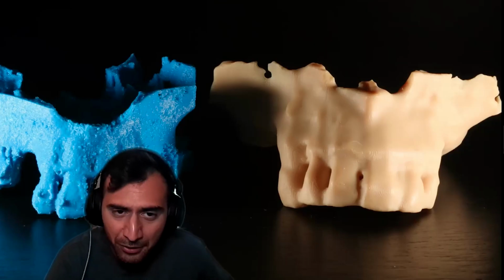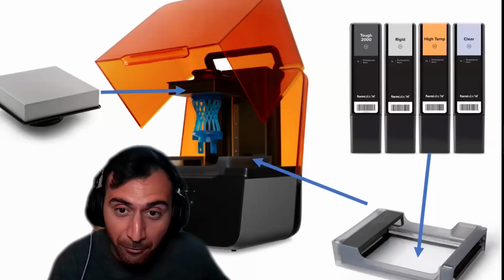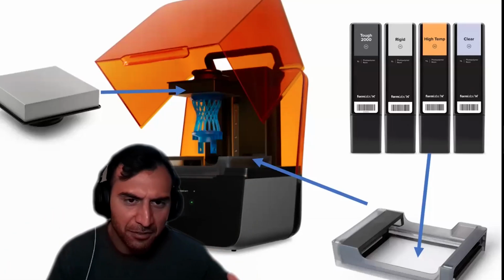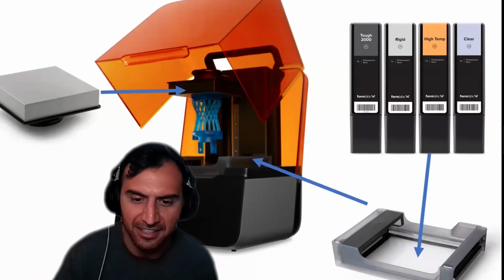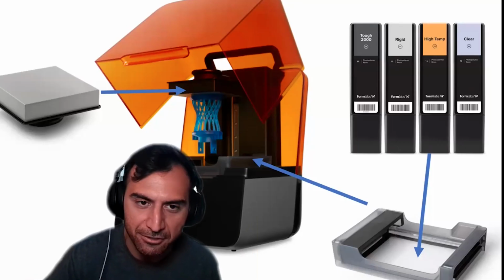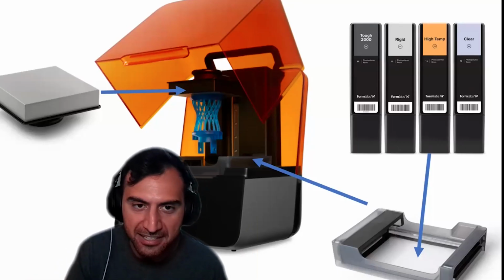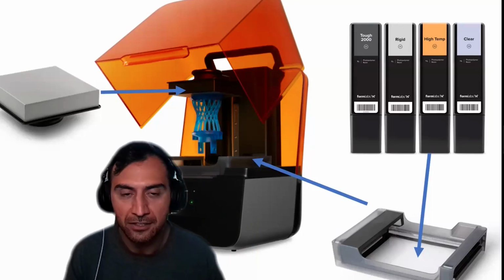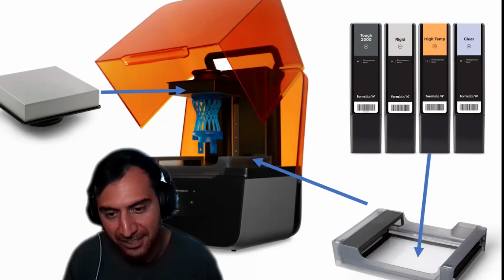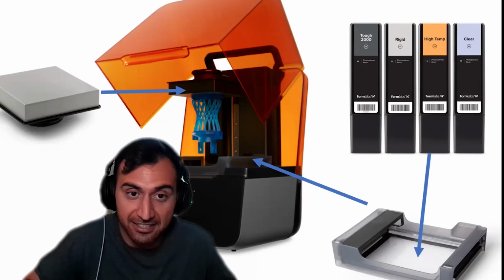But otherwise, if you're going to pick one printer, you're going to pick the resin printers. The basic anatomy for all of them is the same. They're set up differently for the most part, but there is a tank of resin that sits on top of a base unit where all the machinery is. This base is very important. It's where the screen is, and there's a glass layer where the light shoots through. You need to be very careful with that glass layer, but it shoots light upwards and cures the resin sitting in the tank on top of it.